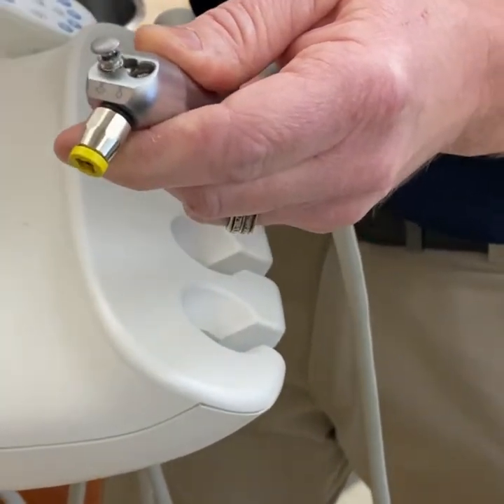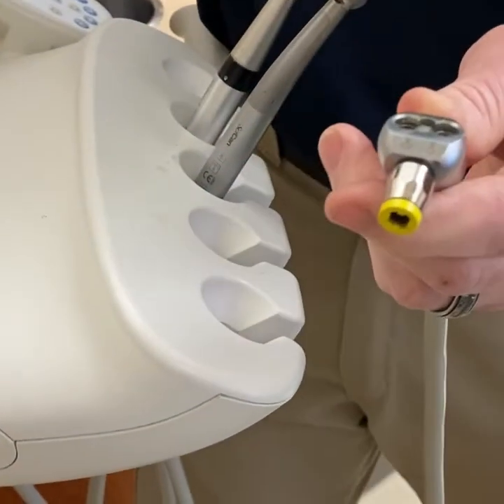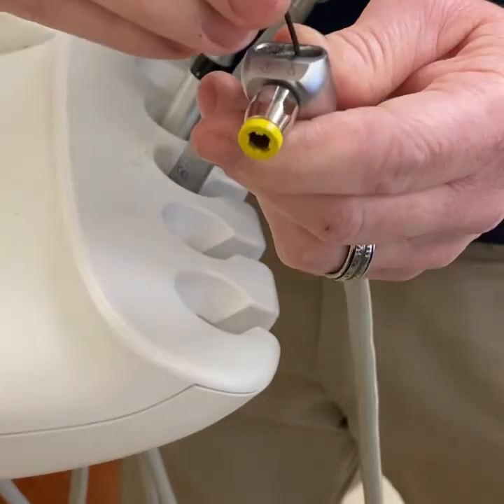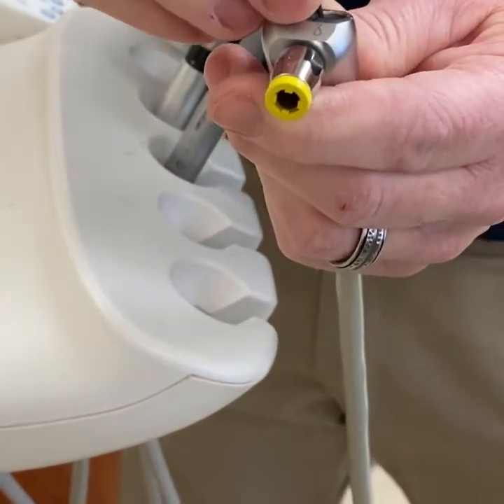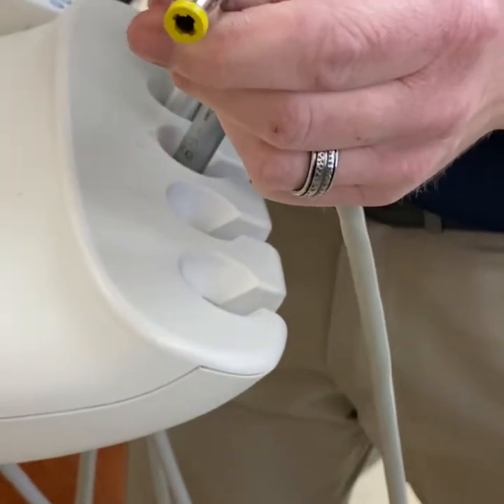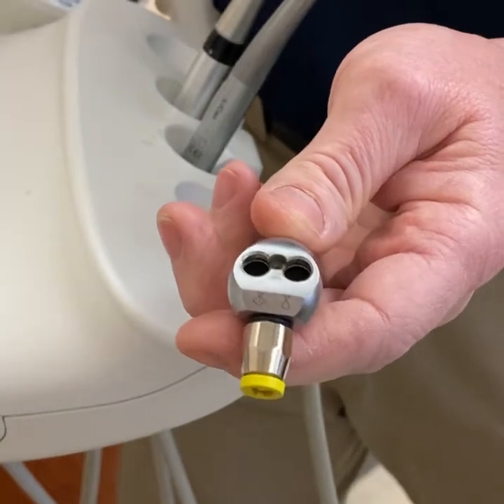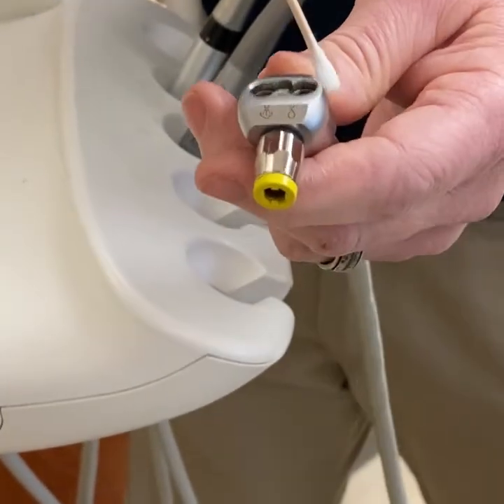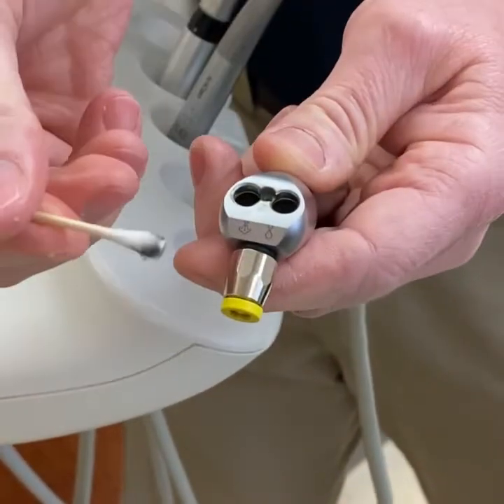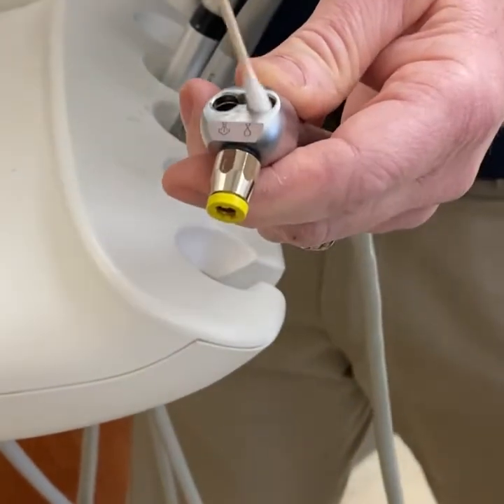Pop out both buttons, and there's also a spring in there that you want to get out. Once the buttons and springs are out, I always like to take a Q-tip and clean these out, because you can get some nasty goop in there.